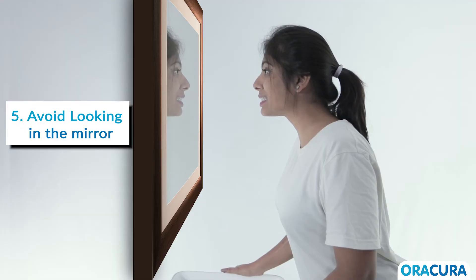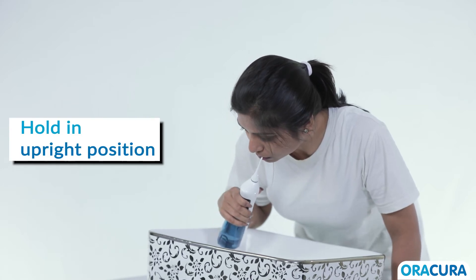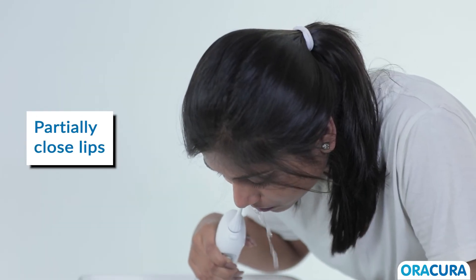Step 5: Avoid looking into the mirror, lean over the sink, and place the tip into your mouth. Hold the unit in an upright position. Slide the jet tip along your gum line to ensure that the water flows vertically. Keep your mouth slightly open to let the water flow out.